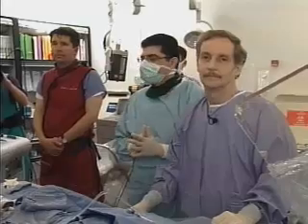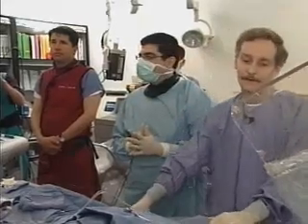We're going to come back to the Cath Lab in just a minute, but I'd like to introduce for the audience the concept of this drug-eluting stent and the reasons that we need this technology to help patients. On the screen you can see a blocked artery on the left. Now this is a typical kind of a blockage inside a heart artery that causes chest discomfort.